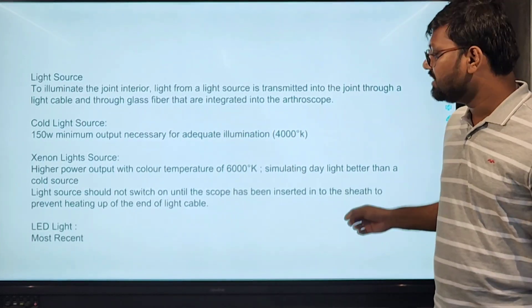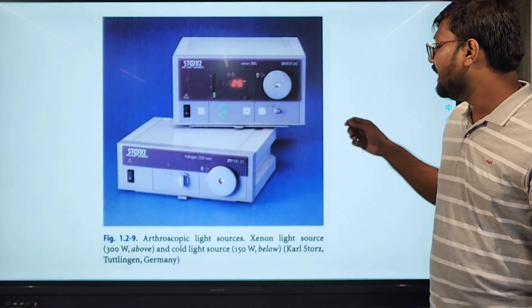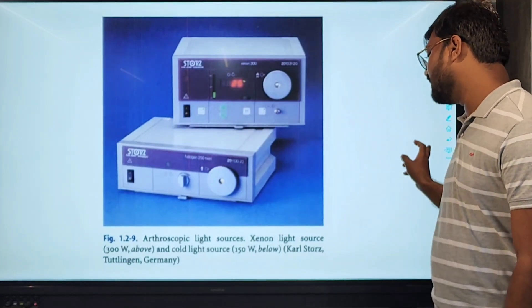A recent advance is LED lights. These are the light sources — the upper one is the xenon light, and the lower one is the cold light source.